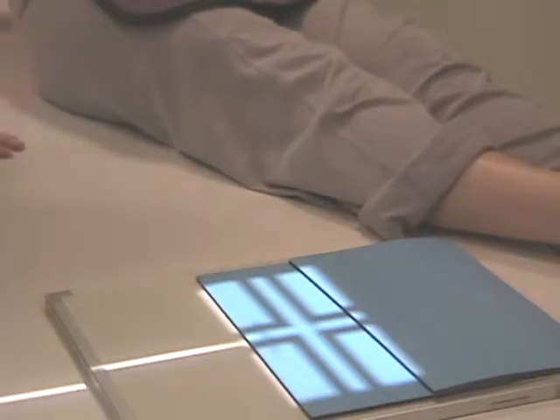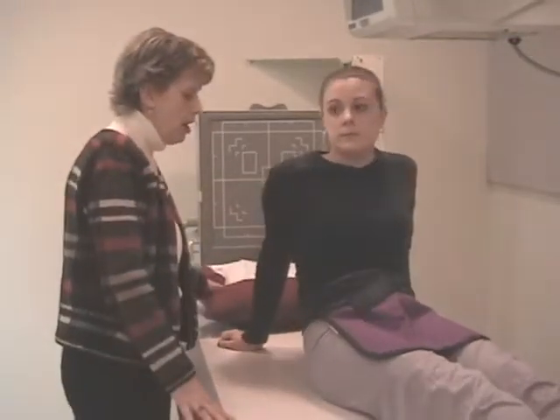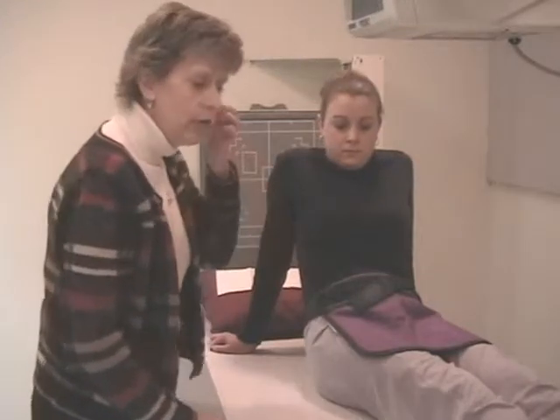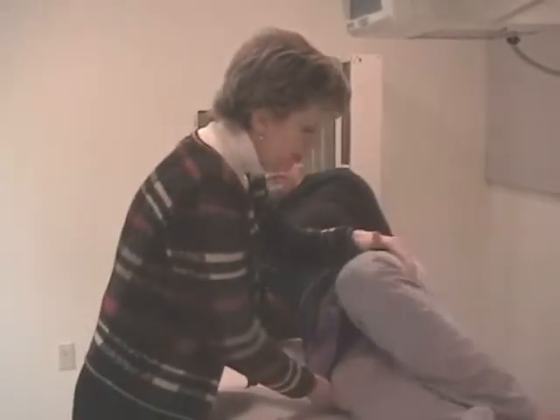Okay. Now, Jacqueline is young and she's mobile. She's sitting up. An elderly patient in a lot of pain, a young patient in a lot of pain, it might be easier for the patient to lie down on the table. I would actually give the option to that patient, ask them how they would be more comfortable, and they'll tell you. When I turn Jacqueline on her side, this is again, the patient might be better off lying down versus sitting up. So we're going to have our patient come onto their injured hip.